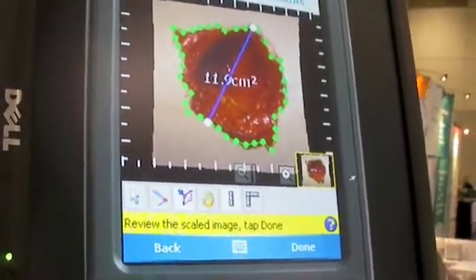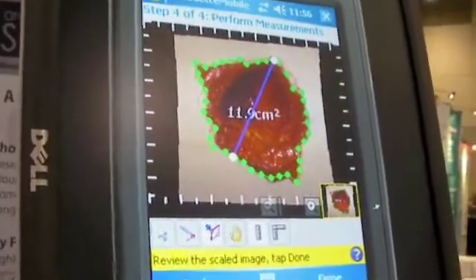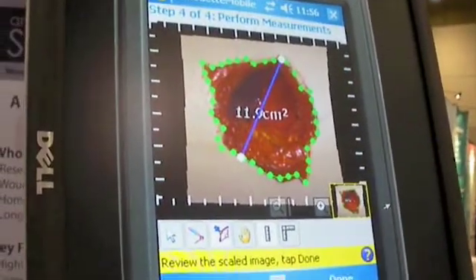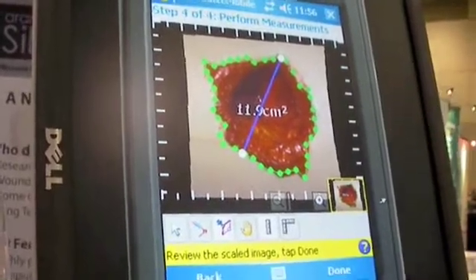We have a scaled image and a surface area measurement. The tick marks around the outside represent one centimetre.